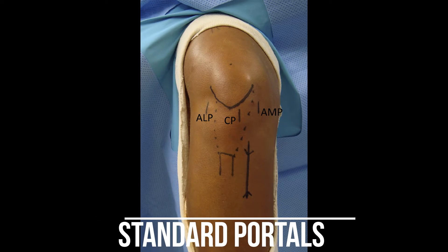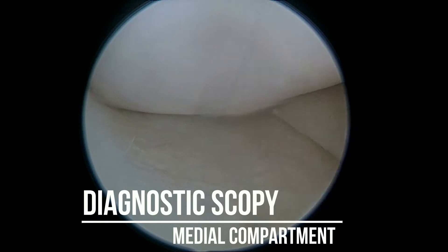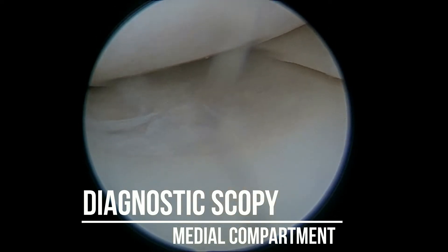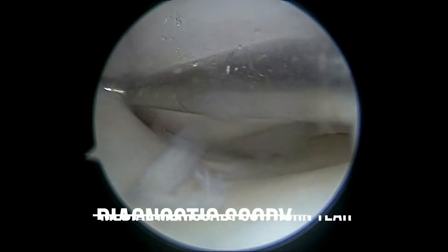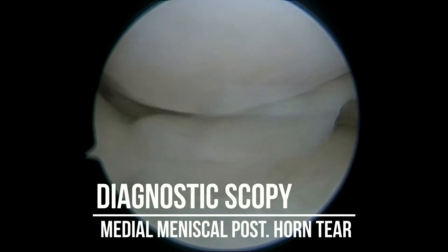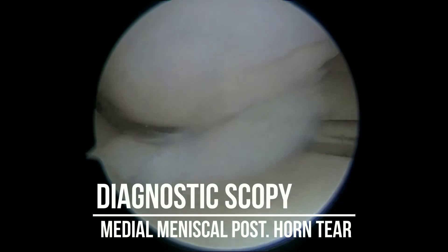The first thing we do is called a diagnostic arthroscopy, in which the medial compartment — the inner side compartment — is visualized with the help of a scope. Here we can see that there are cartilage changes which have already occurred because of a partial meniscal tear, which got impinged between the two bones and indented both surfaces. This is the medial meniscal posterior horn tear, as is quite visible.